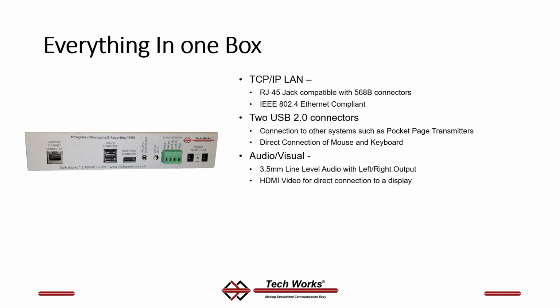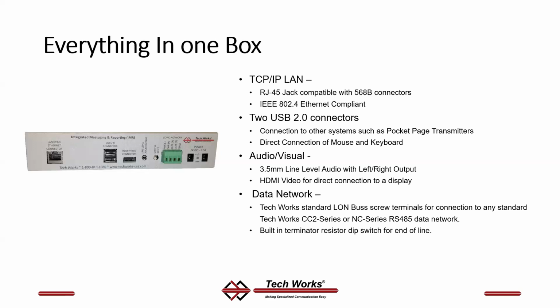Audiovisual, there's 2 connections. There's a 3.5 millimeter line level audio, as well as an HDMI connector for video and audio to an HDMI display. Data networking for the TechWorks data network is supplied via a green Euro connector, just like is on the clinic call, nurse call, and clinical products.